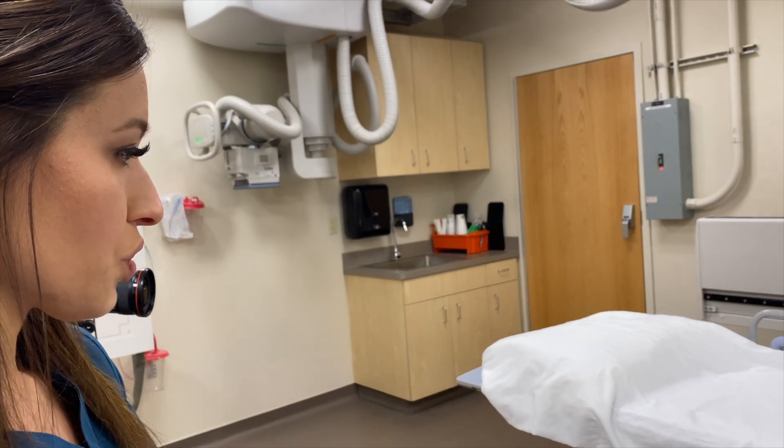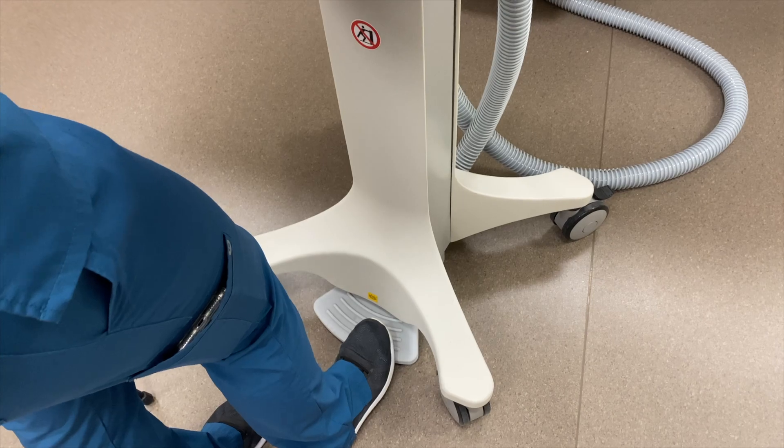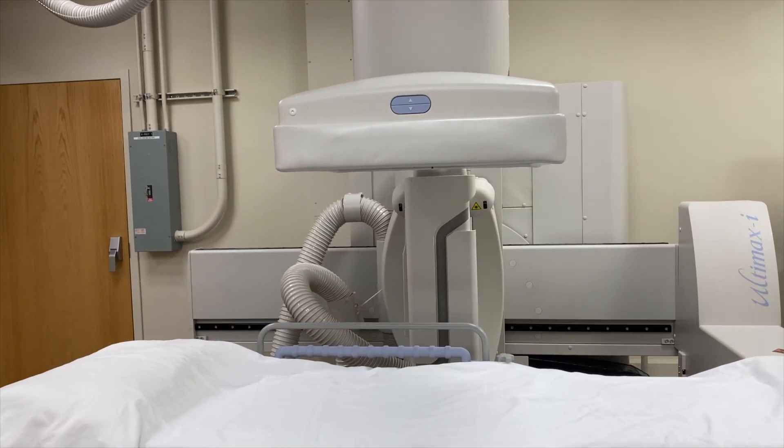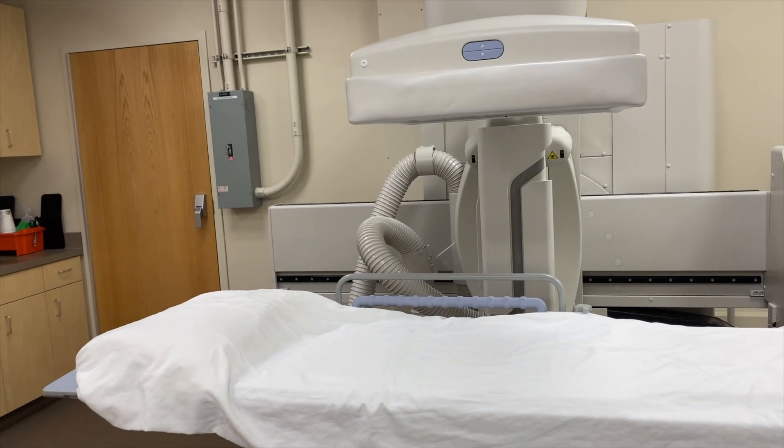It's a lower dose because when you first step on the pedal to fluoro, it's going to use the lowest dose possible, and then it'll only increase up to what it needs to to get a diagnostic image.